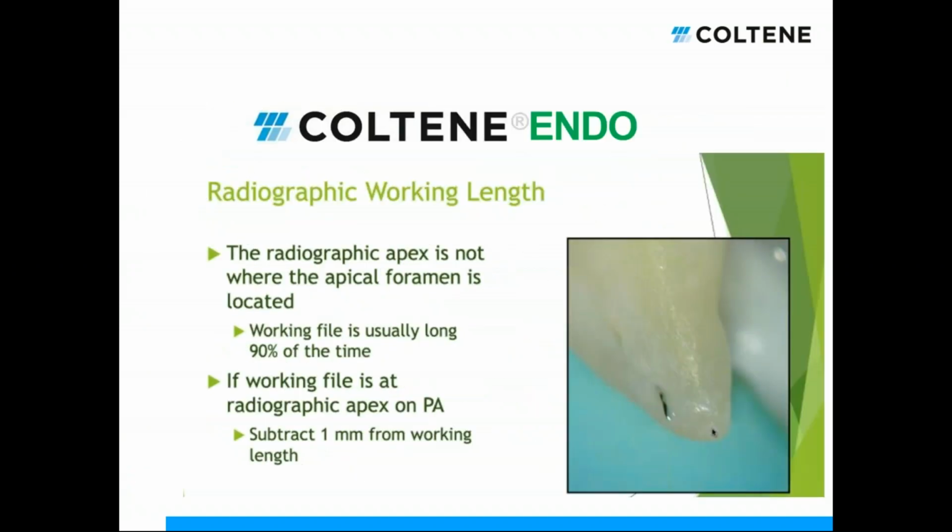Hey Pete, can we have this queued up for Monday with Dr. Albors to really dive into it? I was just going to say, sure. Dr. Albors, I remember at Midwinter a couple years ago, said he does the exact same thing. From what I recall, he takes it to the apex and then backs it up to the second green line. So that's what I've always told offices: take it to the apex and back it up to that second green line. And Dr. Gray, I believe, said the third green line. So either way.